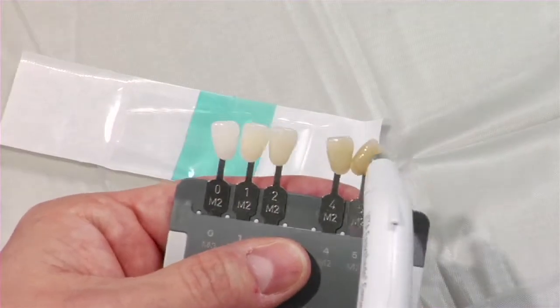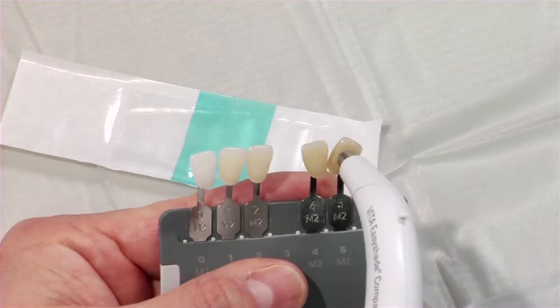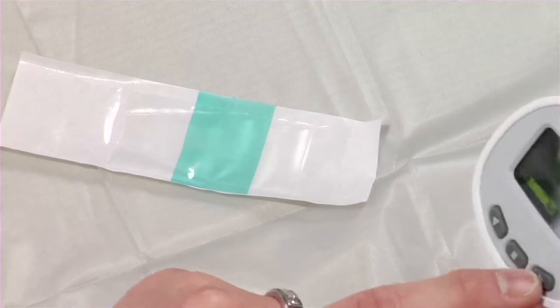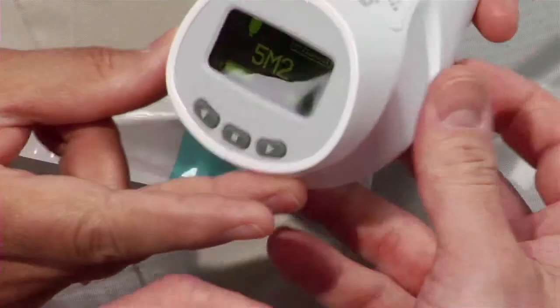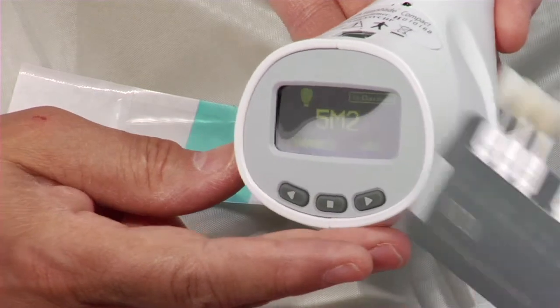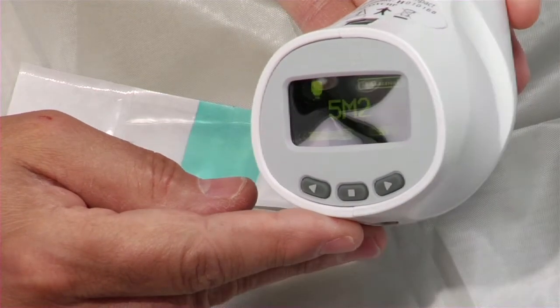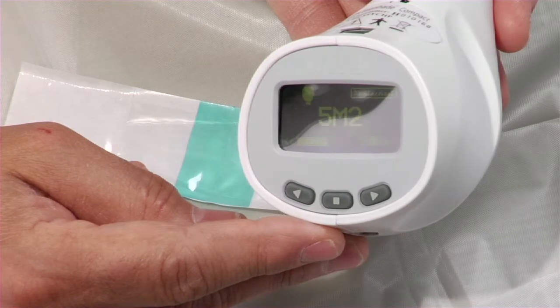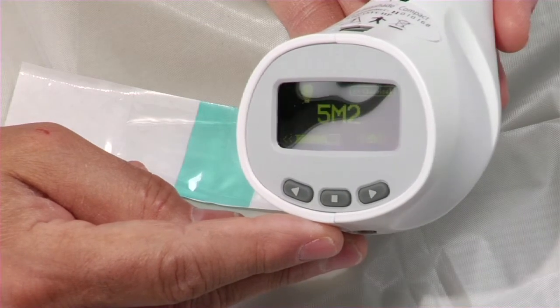Let me demonstrate shade tab mode — I'll put the unit on a shade tab, push the button, and we get 5M2, which is in fact the shade we had selected. It works just as quickly on a patient. In seconds you get your shade. It can also measure either 3D Master or Classic shades — whichever you prefer, it measures both.